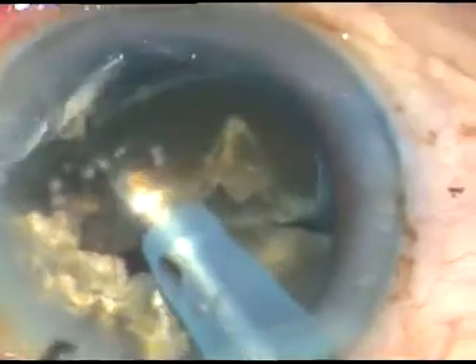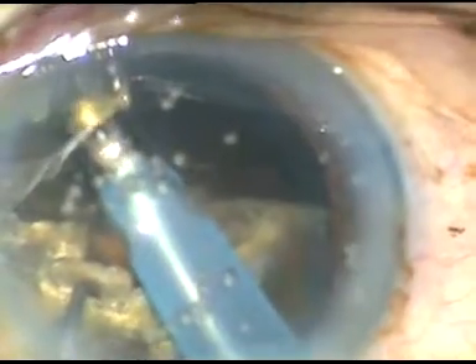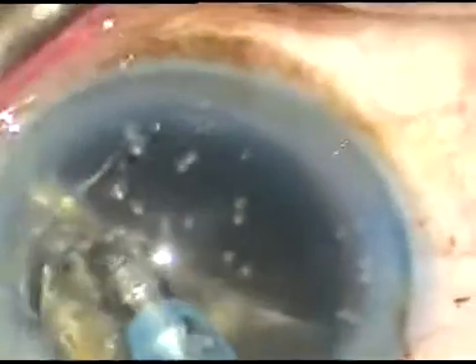I have come out to inject some more viscoelastic substance. You can see some air bubbles sticking to the corneal endothelium — these air bubbles are not moving, indicating that I am at a safe distance from the corneal endothelium and the fluid turbulence is not disturbing them. These sentinel air bubbles mean the endothelium is protected. I am emulsifying these nuclear fragments at the iris plane, always staying at the center of the anterior chamber, because the anterior chamber depth is maximum at the center.